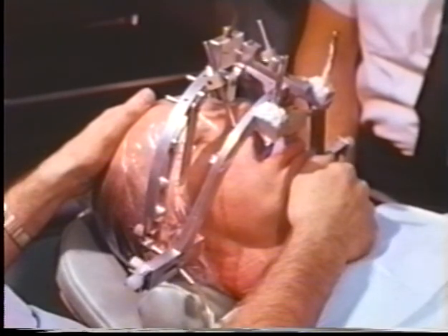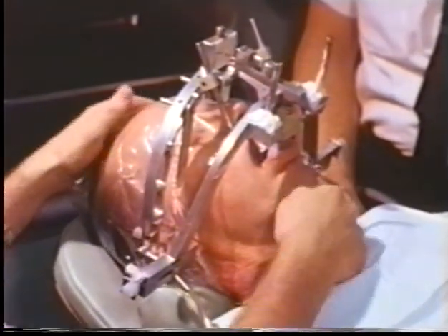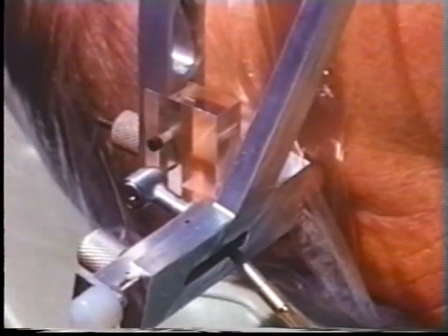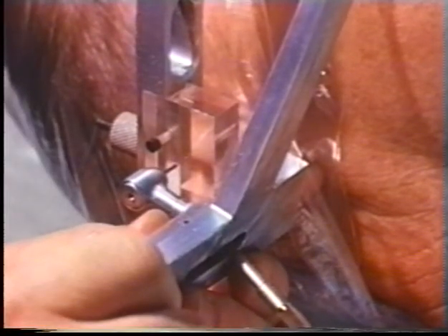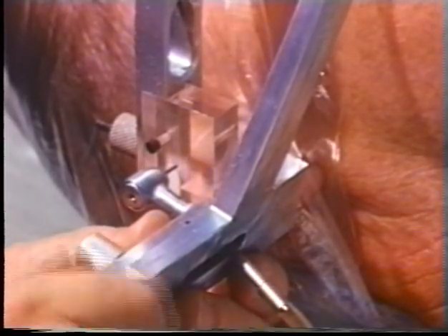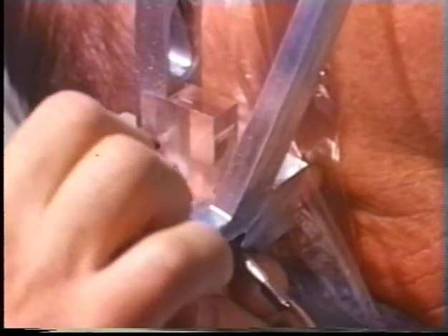The mandible is again placed in centric relation in preparation for recording the movements of the hinge axis. With the mandible in centric relation, the two-axis drills are made to penetrate their associated recording blocks a predetermined depth, as indicated by calibrations on the turbine carriage. The turbine carriages are locked when the drill tips are precisely at the standardized distance of 220 millimeters apart.